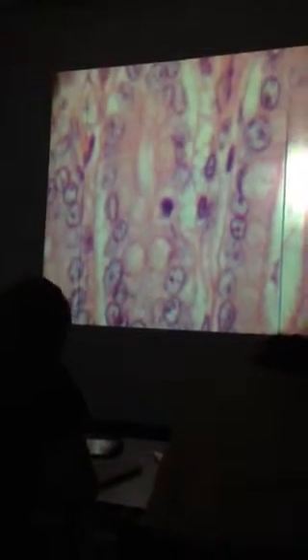Now, enteroendocrine cells are not only found in the stomach, they're found throughout the entire digestive tract. So, from the stomach through the large intestine. So, this could be from the small intestines, large intestines, or stomach. It's really hard to say, but does everybody see that enteroendocrine cell? And how many of you drew an enteroendocrine cell? I think several of you did. Okay. So it's just the dark one in the center.